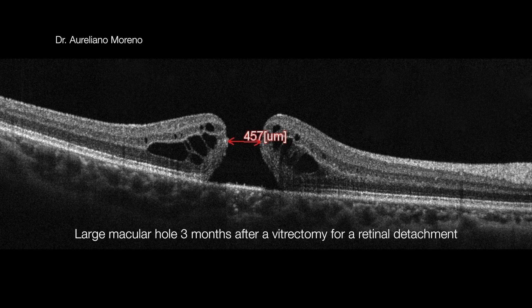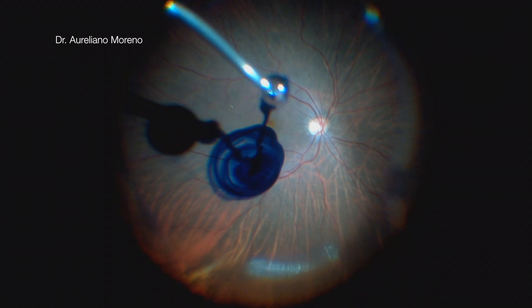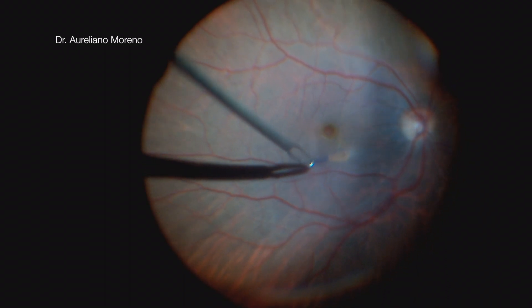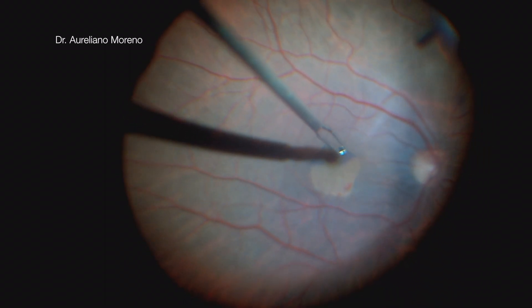The first case is a large macular hole 3 months after a vitrectomy for a retinal detachment. For this case, I decided to perform a modified inverted ILM flap technique. I start on the inferior nasal of the macula because it's more comfortable for me.